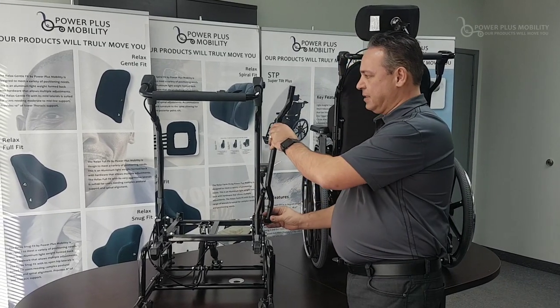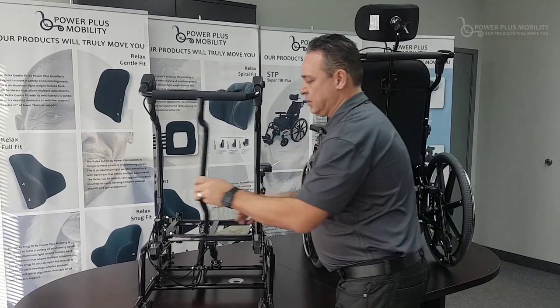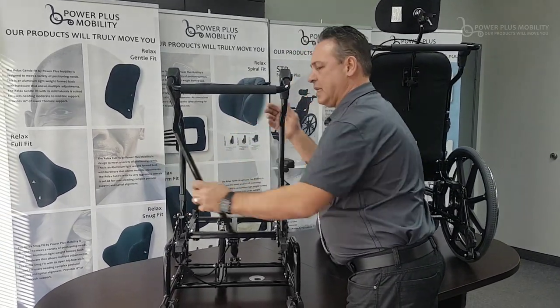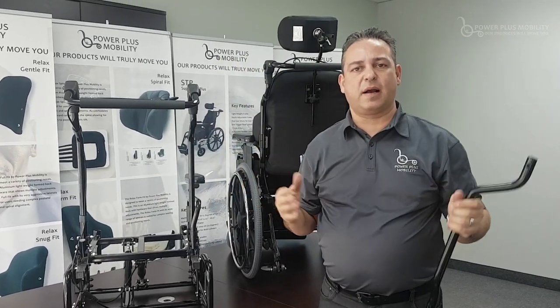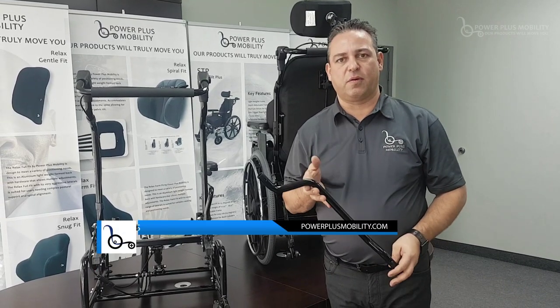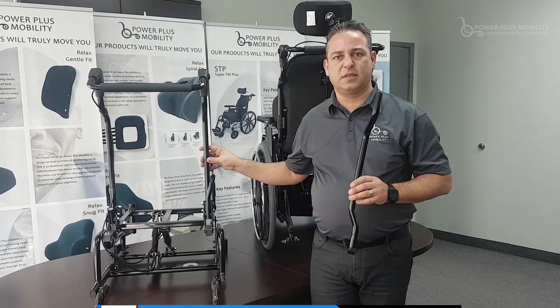We could have the back canes mount on the outside. I'll just mount it here above the frame and now it's sitting in a V shape outward, so we're able to put a 20-inch wide back on an 18-inch wide chair. This is something that's been around for many, many years, but it's one of those things that people just need to be educated a little bit more about.